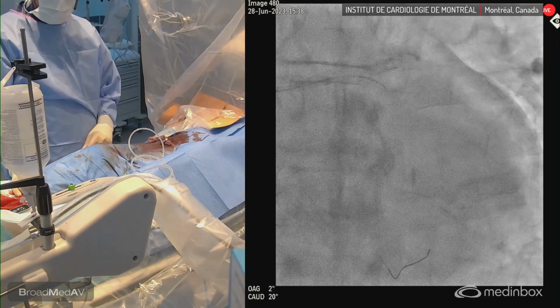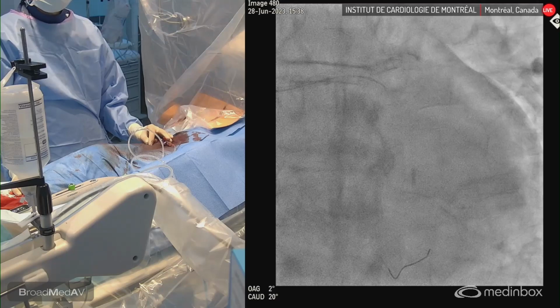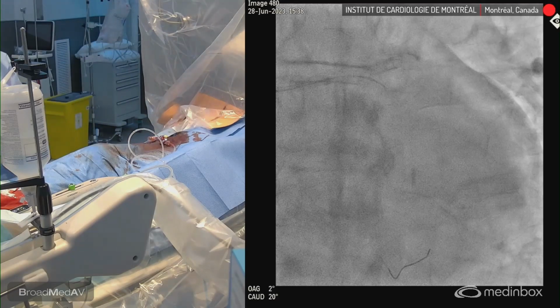So we listen for, exactly. So that's really the key. And usually after 1, 2, 3 runs, you should not hear tonal changes anymore if it did the job. This should allow proper stent expansion, also improve the compliance, so facilitate the stent delivery.